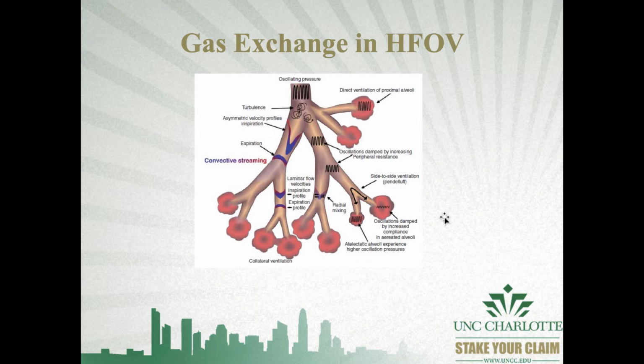there have actually been studies that showed that it increases mortality rates, the OSCILLATE trial and whatnot. And that kind of ruined the reputation of the oscillator, but you always have to understand clinician experience when we're implementing these strategies. And this is in adults. We're not talking about kids.